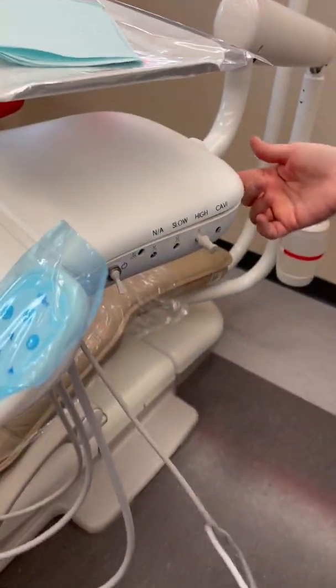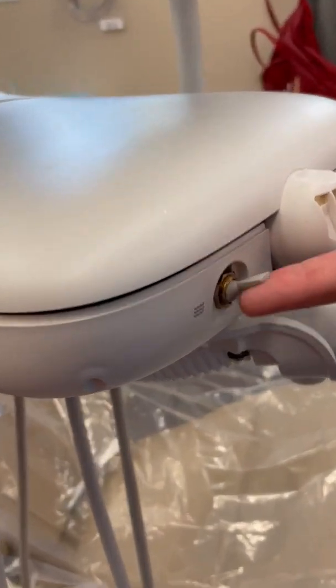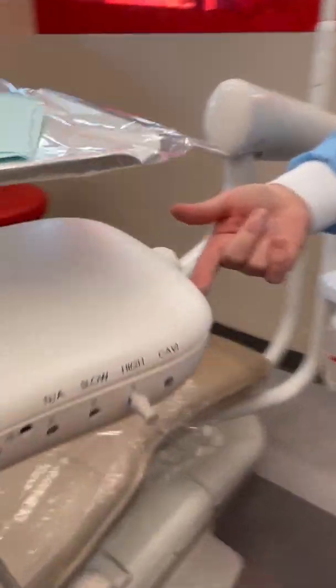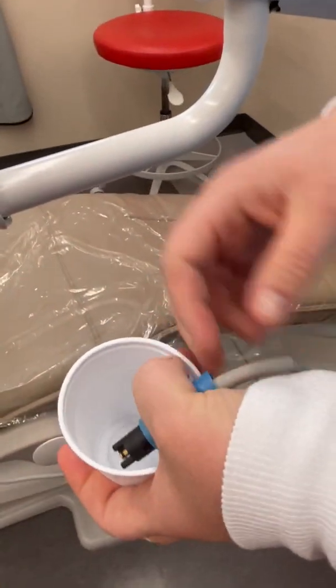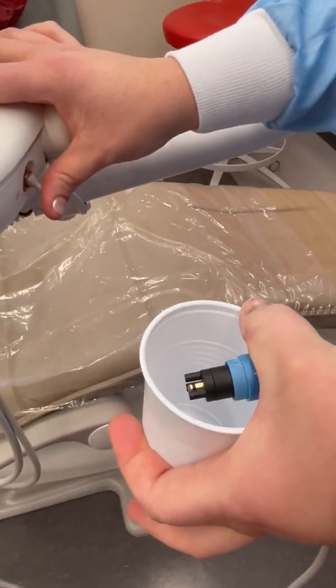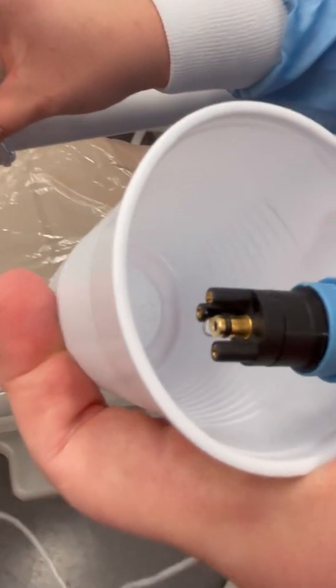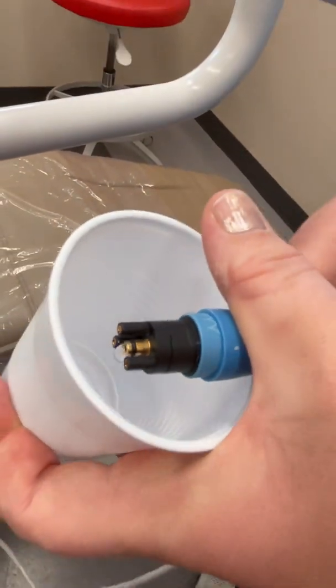On the back of the unit is a water flush. Grab a cup, flip the water flush, and you'll get water coming up. Can you see the water? Okay, water is working.